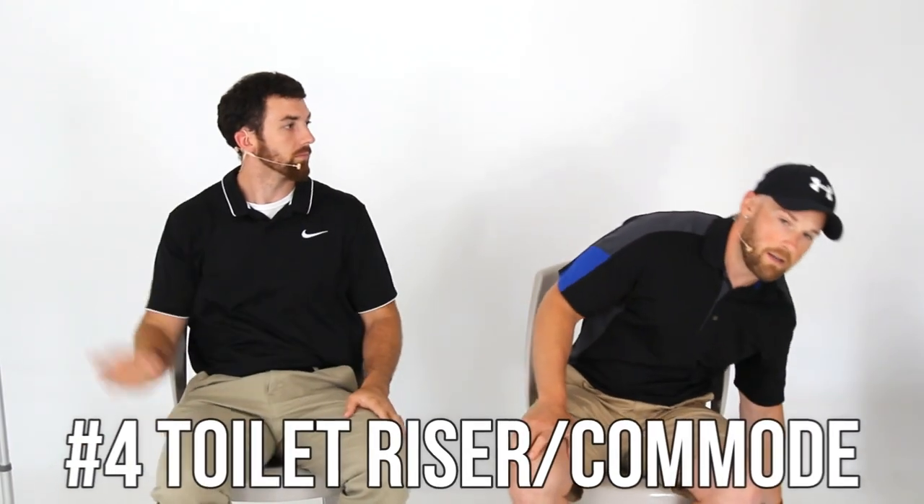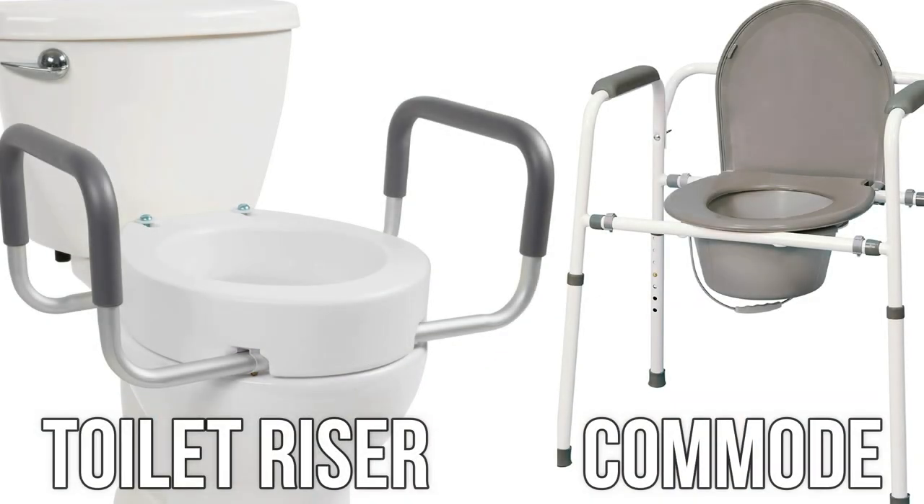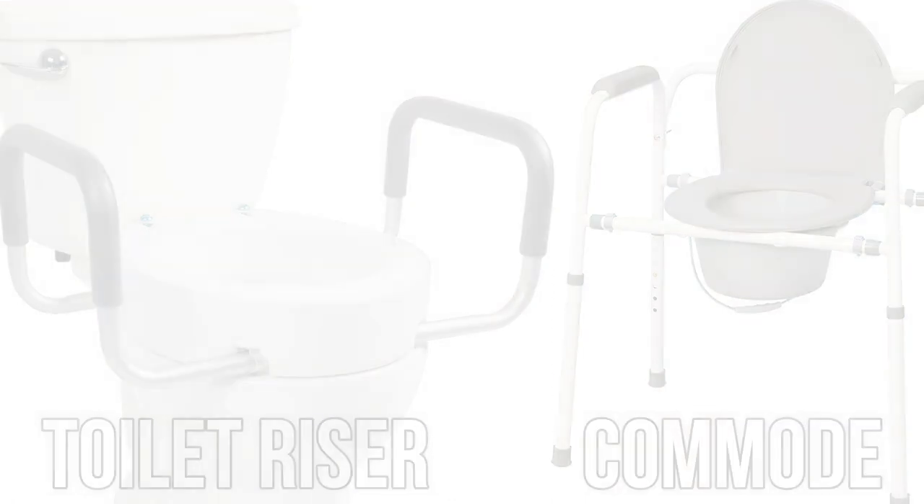Number four is a toilet riser or commode. These go over your toilet and typically have handlebars. It makes it much easier to get on and off your toilet because after a knee replacement, it hurts to bend down that far — and some people can't even bend that far. What you'll probably want to do is kick your bad leg out as you lower yourself down.